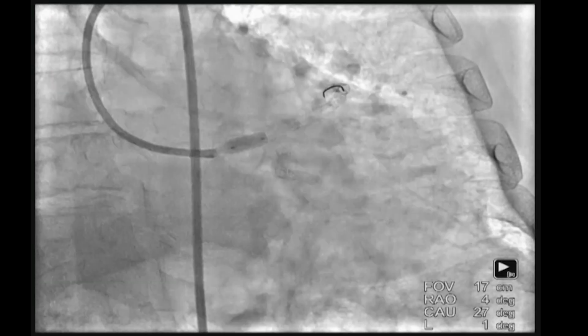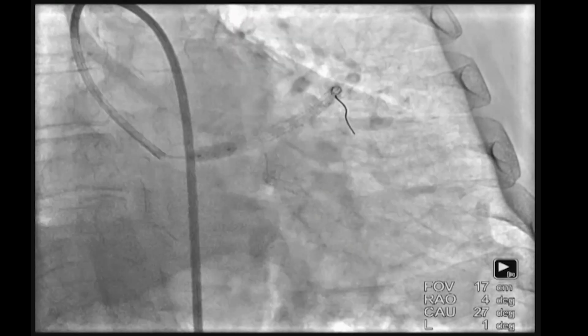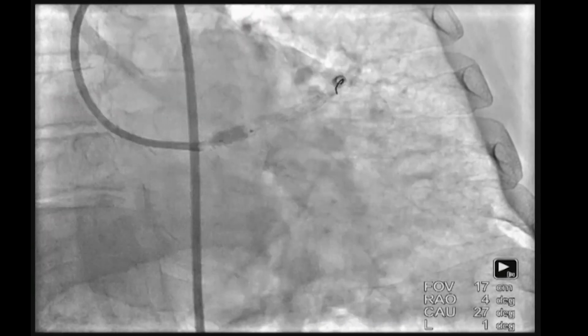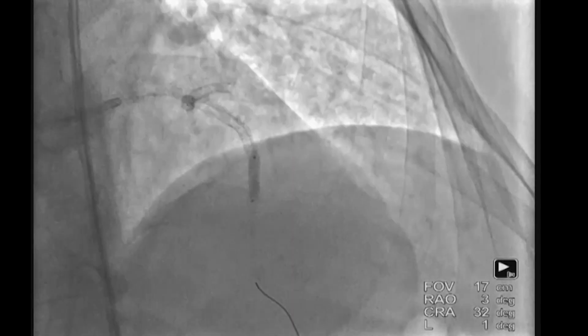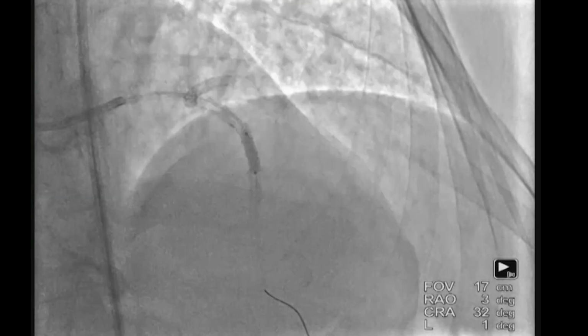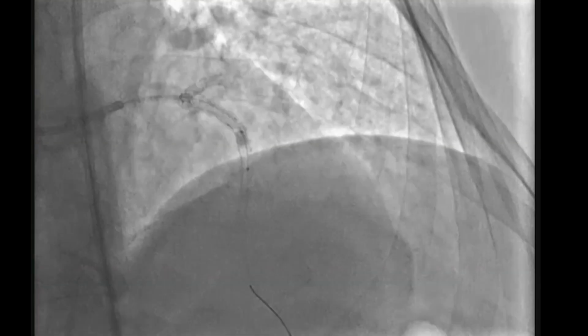After stenting the left main to LAD stent, we did the POT balloon using the 4.5 by 8 mm balloon, from the carina to the ostium, including ostial flaring. After that, again a 3.5 mm balloon was taken, and the LAD was further dilated because in the calcified vessel, some under expansion may be there.